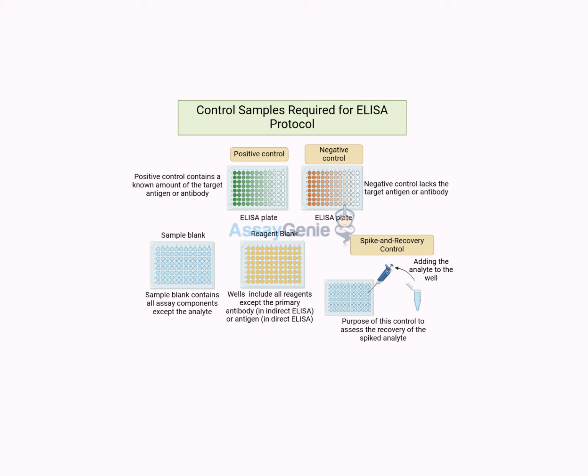Right, because a false positive in this context could have really serious consequences. It could lead to a misdiagnosis, unnecessary anxiety, and even like inappropriate treatment. Yeah, exactly. So in a diagnostic setting, those positive and negative controls are just absolutely essential for making sure we get those accurate and reliable results, which of course directly impact patient care. That's a powerful reminder of what's at stake here.